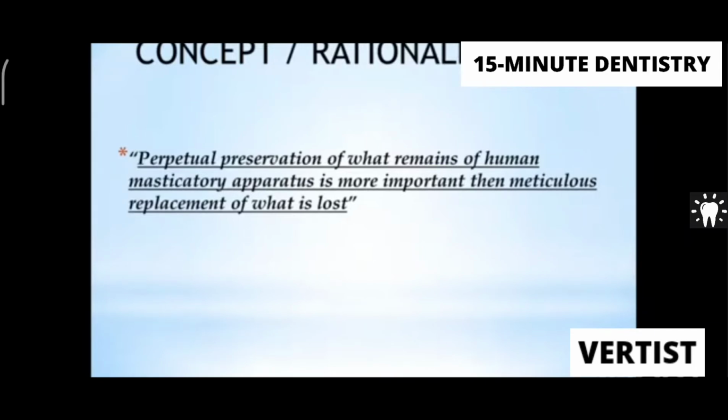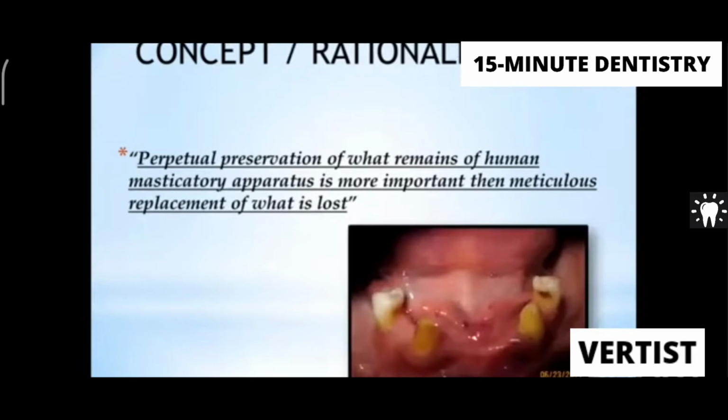This is, I think, the Bible statement you can say of prosthodontics, right? So we are here always trying to preserve what is there and not just replace what is missing, right? So think about this case. Now just imagine this case.